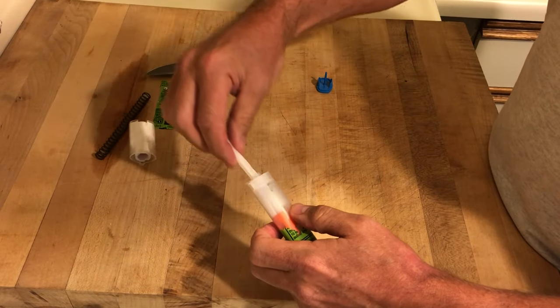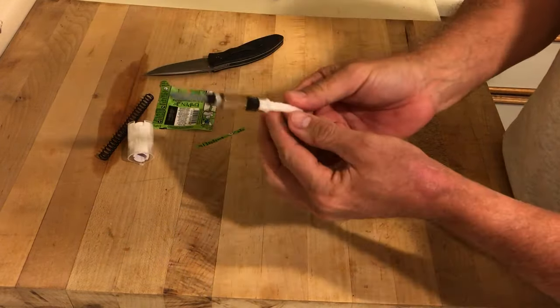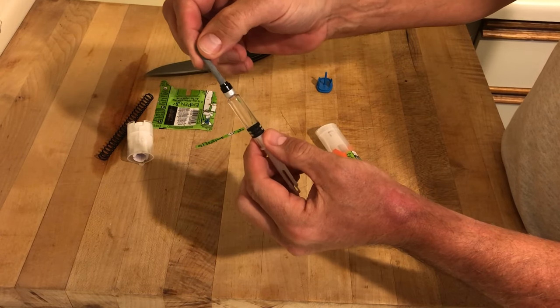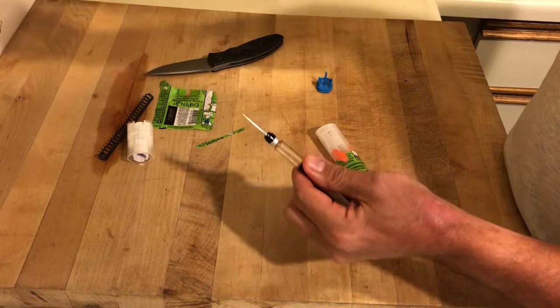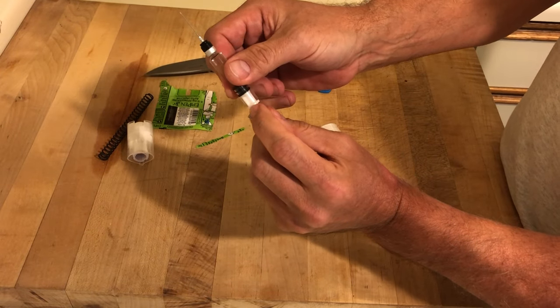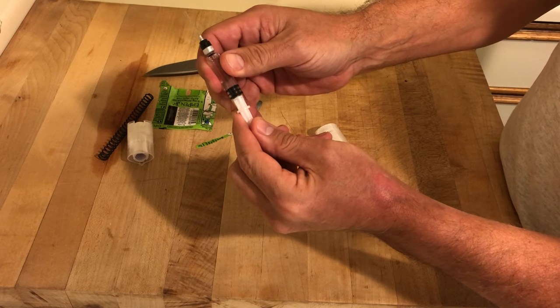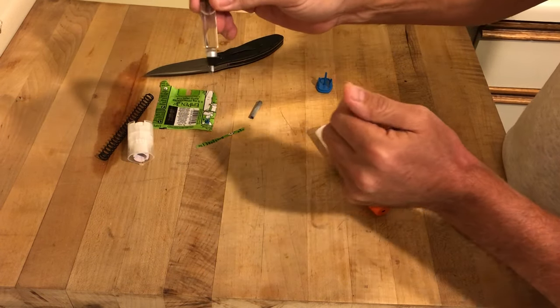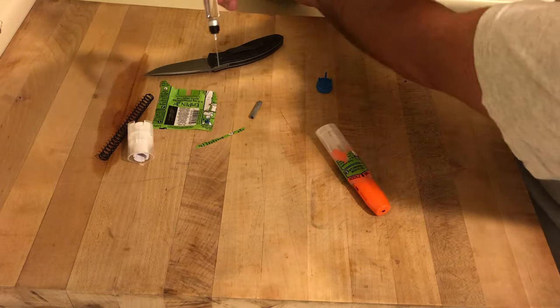When you pull the spring off, there's the carpule and you can see that there's a lot of Epi left inside it. We're going to take off the sheath covering the needle — and there it is. You'll notice there's also a stop on the back of the needle. Pull the plunger out to get a little air in there while it's pointing up, and then you can point it down to give your next dose of Epi.